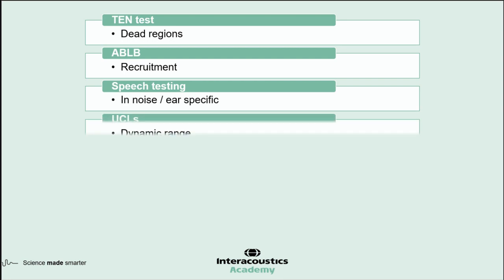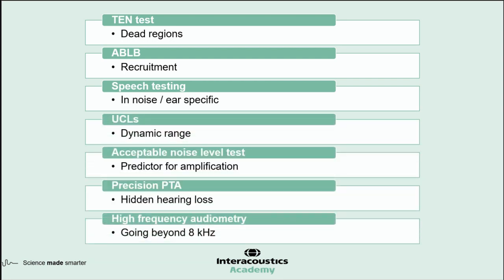So what can we do that goes beyond the audiogram? In terms of actual tests that accompany our audiometry, there's a whole host, and the ones that I put up on the screen now are by no means an exhaustive selection. There's plenty more that I could go on about, but I'm going to go through these ones because I think they're quite an interesting selection, and they cover a range of different pathologies and situations that you might encounter.